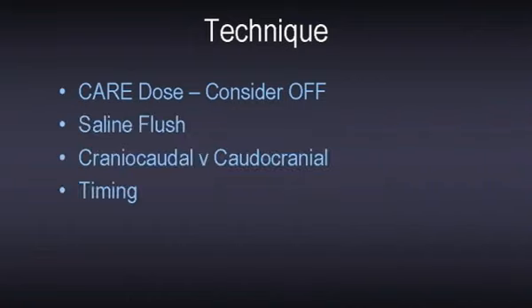Using a saline flush, you can significantly reduce the volume of contrast that you wish to deliver and reduce artifacts in the central systemic venous vasculature. If you have a single detector scanner or an older generation multi-detector scanner, caudocranial imaging may reduce motion artifact at the end of the breath hold. But for the newer generation multi-detector scanners, it remains much simpler to perform craniocaudal imaging throughout the examination.